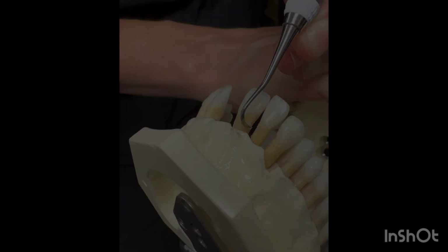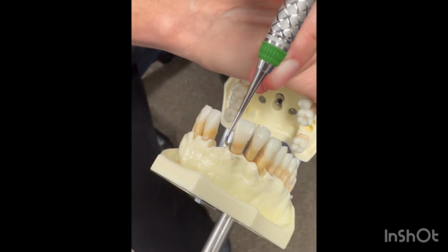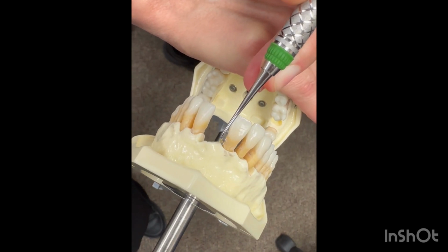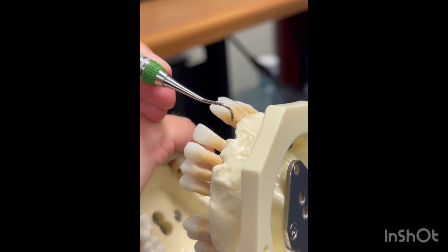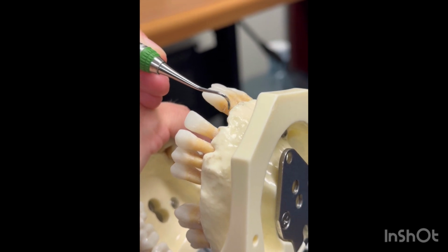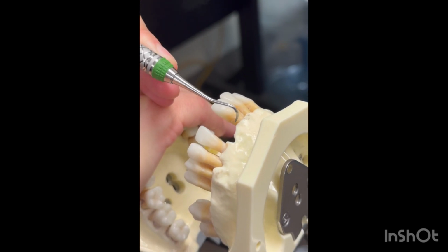Here Janelle is demoing the 7/8 on the mesial and distal surfaces of tooth number 8. It's important to remember when scaling these surfaces to get all the way to the base of the pocket, to not leave any residuals behind, and to maintain adaptation while scaling. You can see here how her shank is parallel to the tooth that she's scaling to ensure that she's properly adapted.